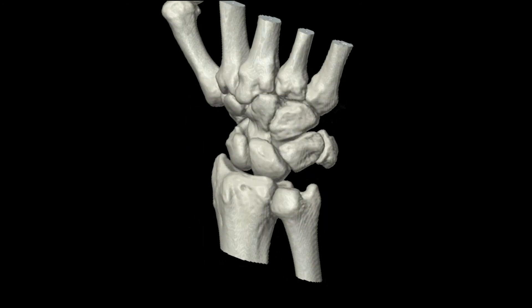We tailor it to the particular manoeuvre which is causing the patient's symptoms, be it a form of instability or a form of impingement. We reproduce that manoeuvre with them on the CT table to be able to demonstrate the pathology dynamically rather than with static imaging.